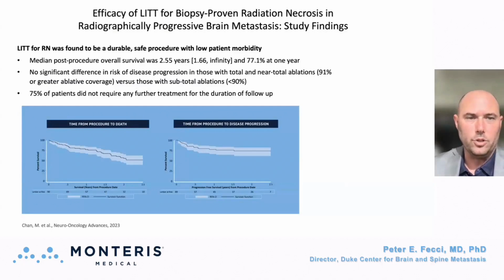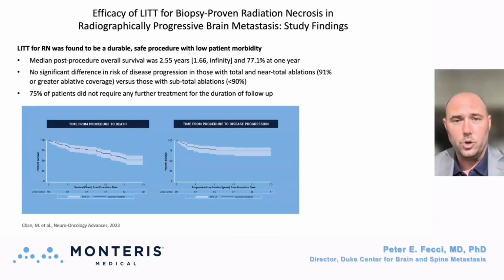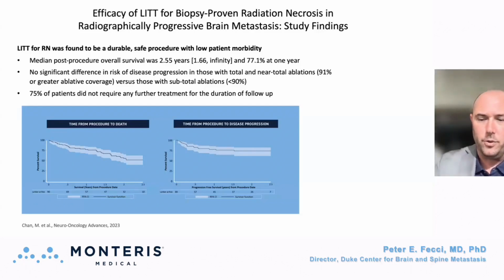This, again, is showing some more of the survival outcomes in that study. Median post-procedure overall survival was 2.5 years. And there was no significant difference, and this is quite interesting, in those who got near total ablations and total ablations. If you got more than 90% out or cooked with the laser, basically you had equivalent outcomes. And most patients really didn't require any further treatment for the duration of their follow-up.